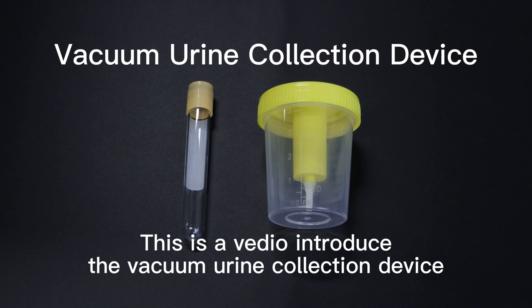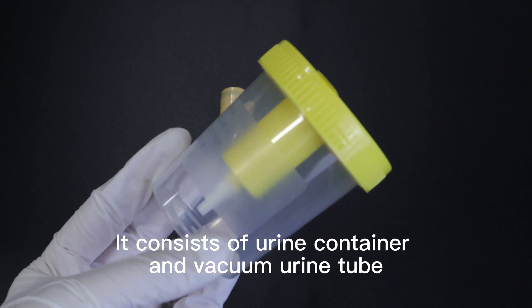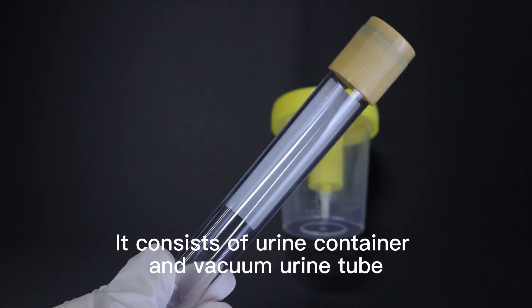This is a video introducing the vacuum urine collection device. It consists of a urine container and a vacuum urine tube.